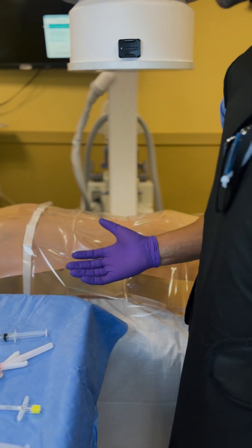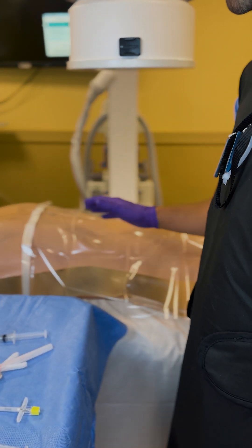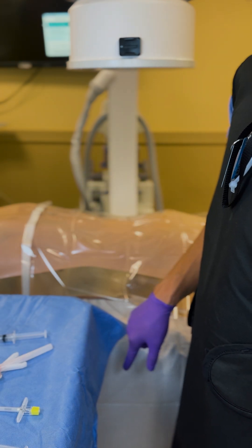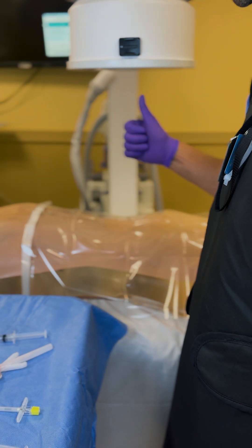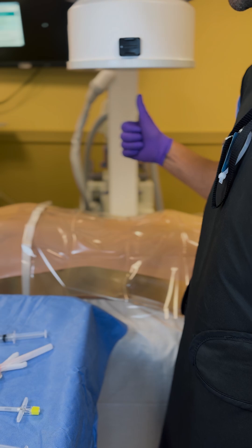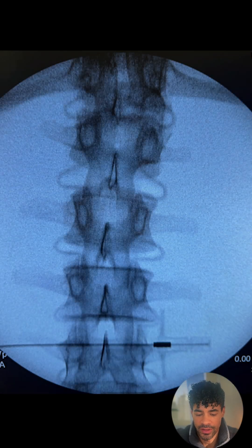We'll now take an AP image of the lumbar spine. AP means anterior-posterior: the image source is coming from the anterior of the patient, and the image intensifier at the posterior is capturing the X-ray image. Once you have an AP image of the lumbar spine you're content with, let's talk about some of the fluoroscopic anatomy.